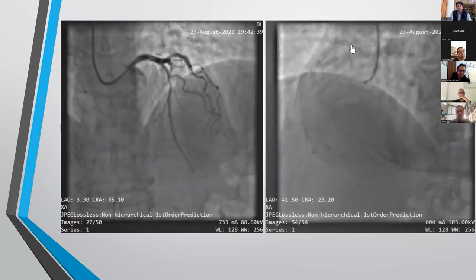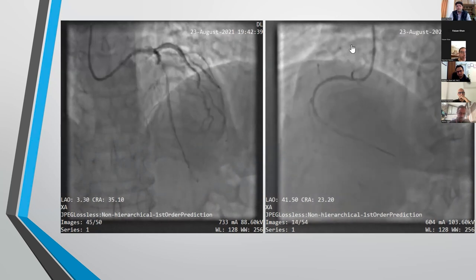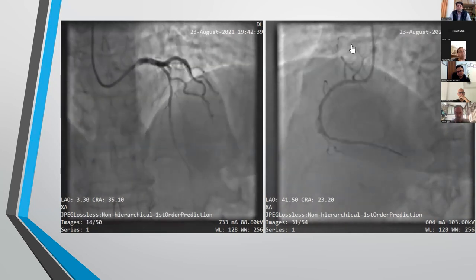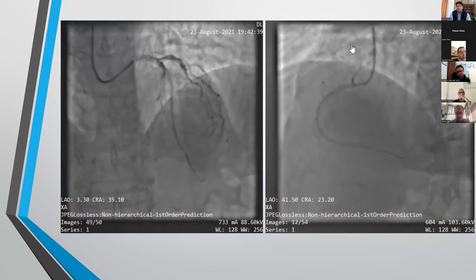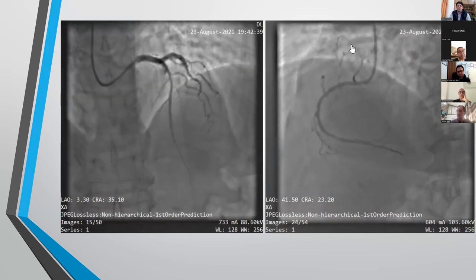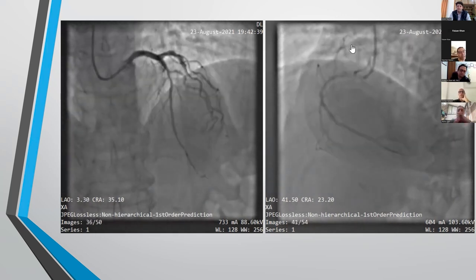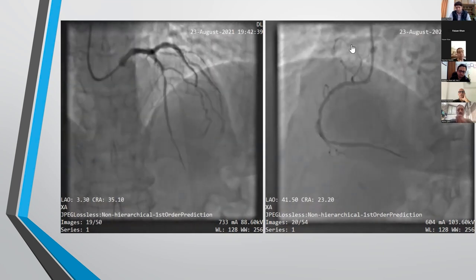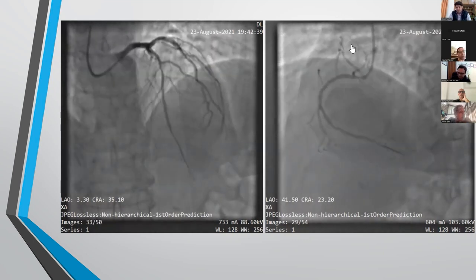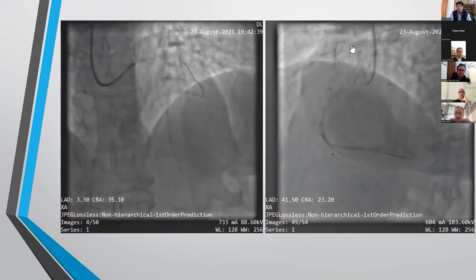और डेफिनेटली पहले आप जब जीरो करते हैं तो कॉइल में रख के 30 सेकेंड्स, फिर आप हुकअप करें, और फिर इक्वलाइजेशन के लिए बटन दबाएं। इक्वलाइजेशन के वक्त इंपॉर्टेंट पॉइंट है कि आपने जो इंसर्शन टूल डाला हो जिससे वायर लेके जाते हैं, उसको बाहर निकाला हो, और सेलिन के साथ फ्लश करके स्टेबल चीजें रख के तो फिर आप इक्वलाइजेशन का बटन दबाएं ताकि get a proper equal recording. So these are very important, crucial, ये 2-3 पॉइंट्स जो कि रिकॉर्डिंग के वक्त बहुत इंपॉर्टेंट हैं, as Bashir sahab pointed out as well, for proper FFR IFR recording.